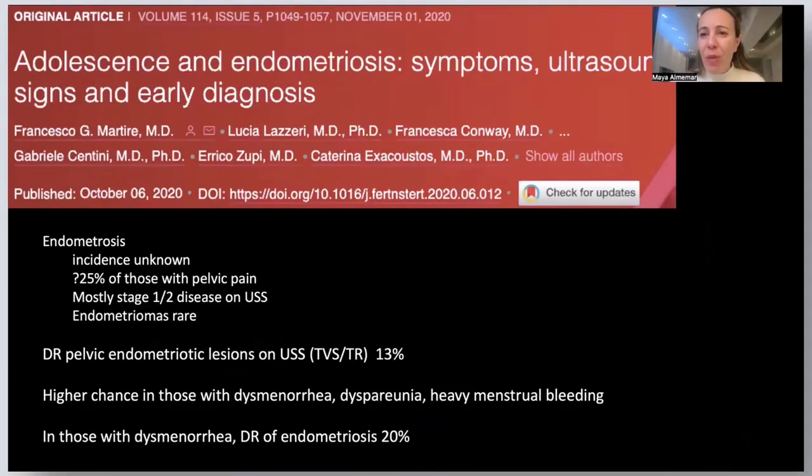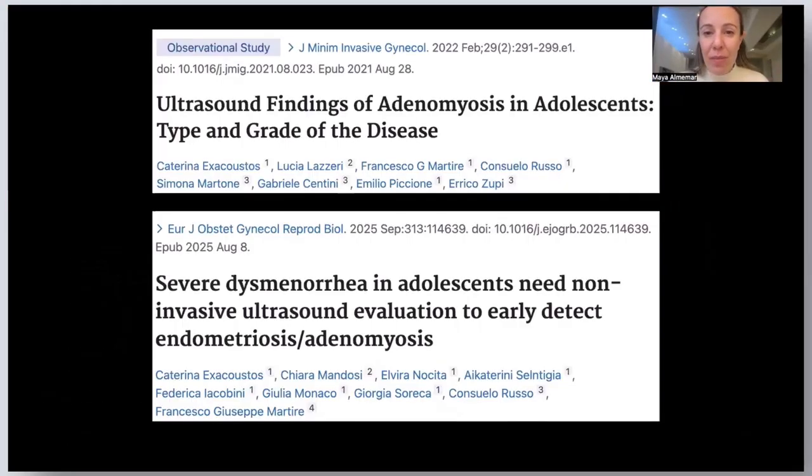What might we see in terms of pathology in adolescents who have terrible periods? Well, interestingly, this work has really been led by Katerina Exarchoustos, who's published fantastic papers and work on abnormal bleeding in the adolescent population. And she's found that actually you could detect in those with quite severe disease, 13% will have deep pelvic endometriosis. She's also demonstrated findings of adenomyosis, and more recently, very interestingly, in a cohort of patients with quite severe dysmenorrhea in adolescents, you can detect mild features of endometriosis in about 40%.